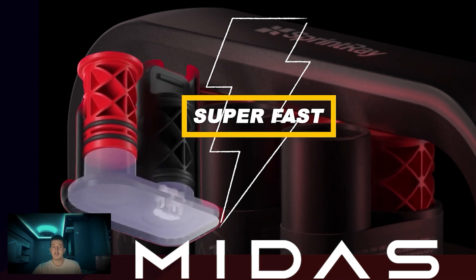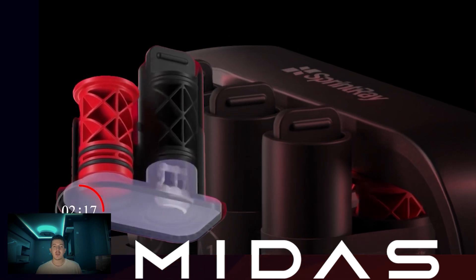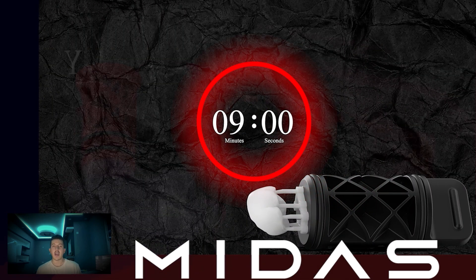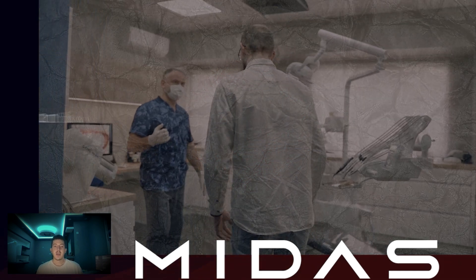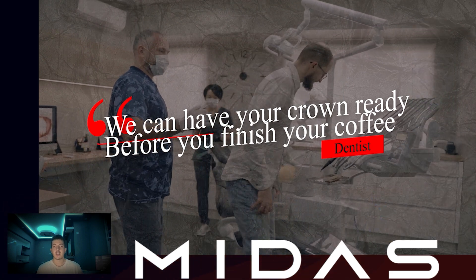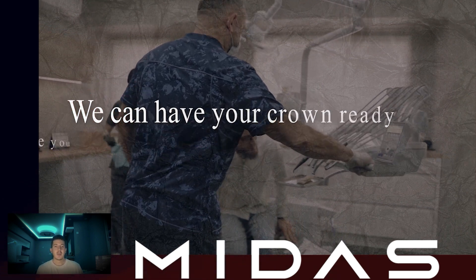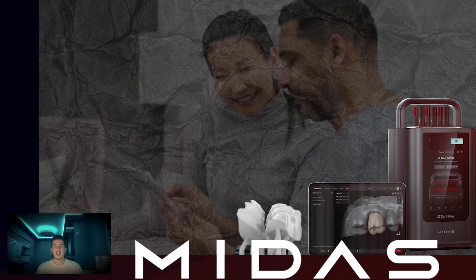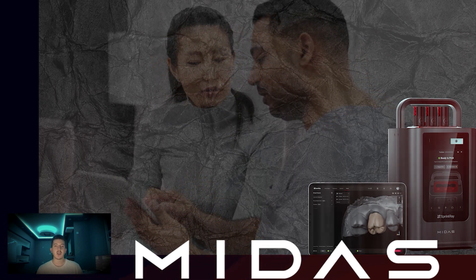One of the standout features of the MEDAS is its incredible speed. This printer can produce a dental crown in just 8 to 9 minutes. Imagine telling your patient: 'We can have your crown ready before you finish your coffee.' That seemed really impossible two or three years ago. That's the kind of service the MEDAS enables, significantly improving patient satisfaction and reducing chair time.